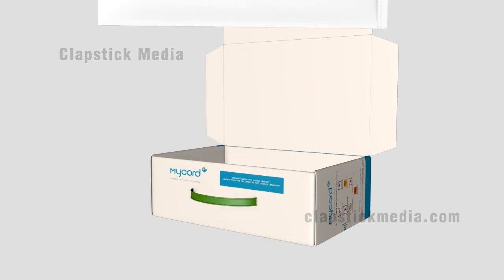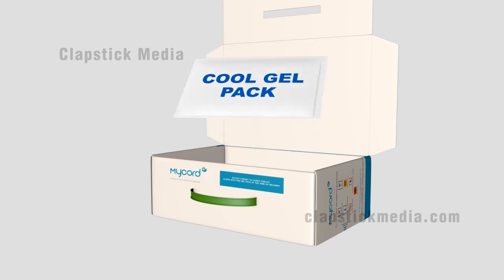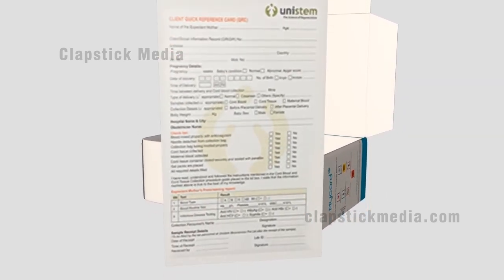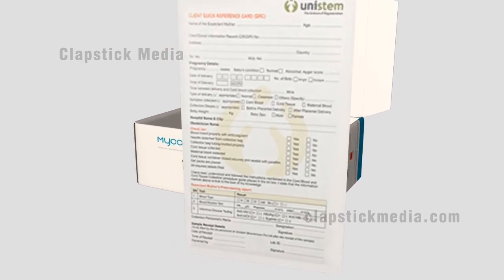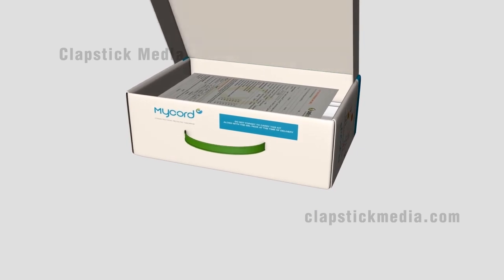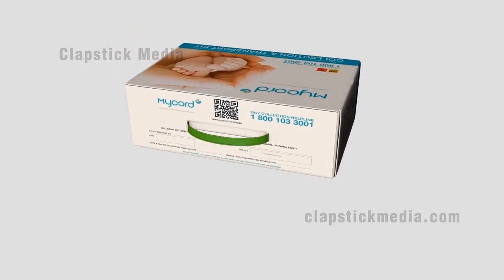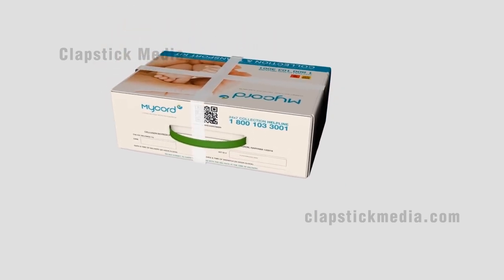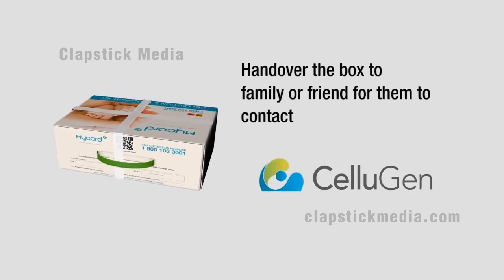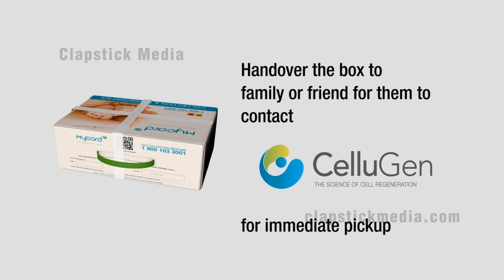Put the cool gel pack over the contents to maintain optimum temperature. Fill in the quick reference card provided with the proper details and put it in the box. Close the box and secure the packet with the adhesive tape provided. Hand over the box to a family member or friend for them to contact Cellugen for immediate pickup.